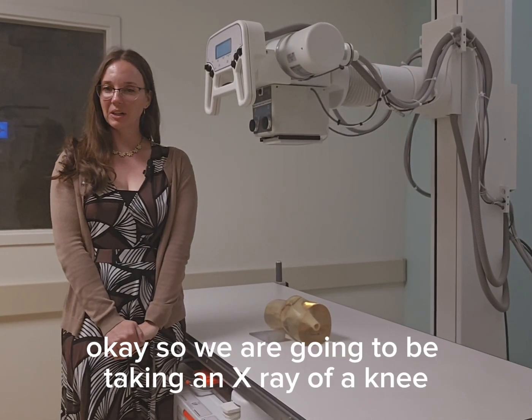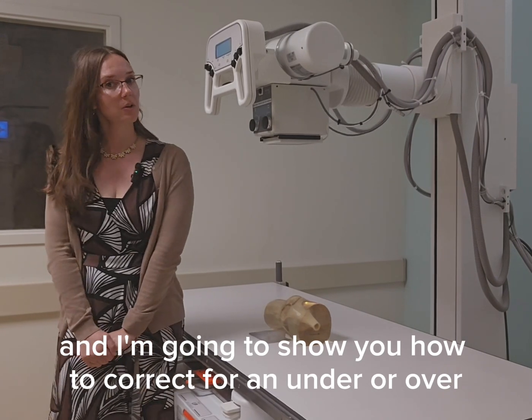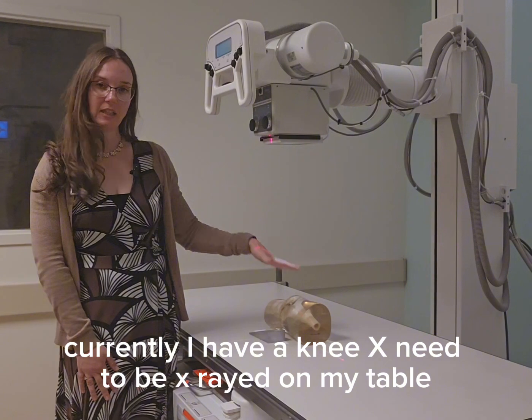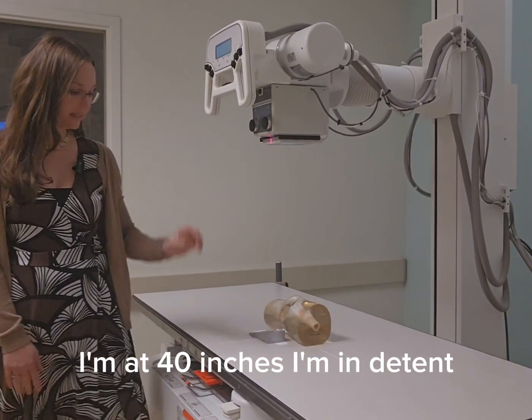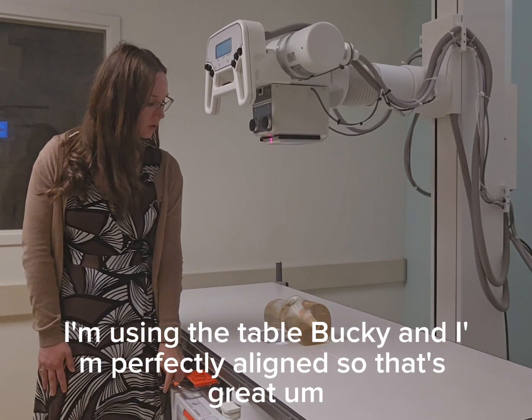Okay, so we are going to be taking an x-ray of a knee, and I'm going to show you how to correct for an under or overexposed picture using the 15% rule. Currently, I have a knee to be x-rayed on my table. I'm at 40 inches, I'm in detent, I'm using the table bucky, and I'm perfectly aligned, so that's great.